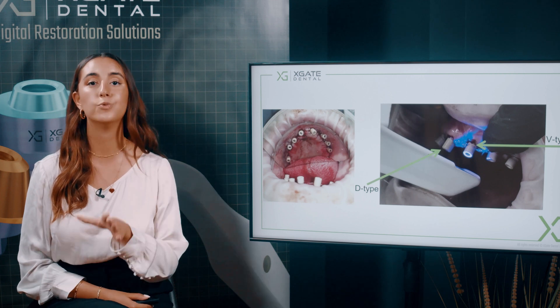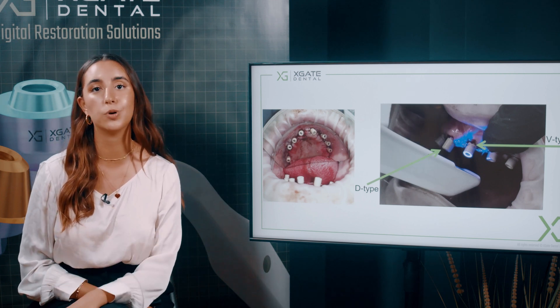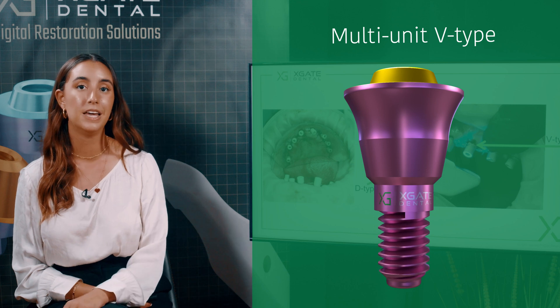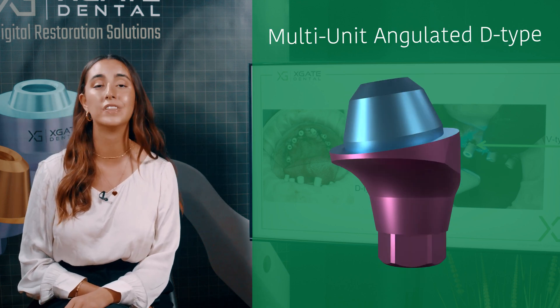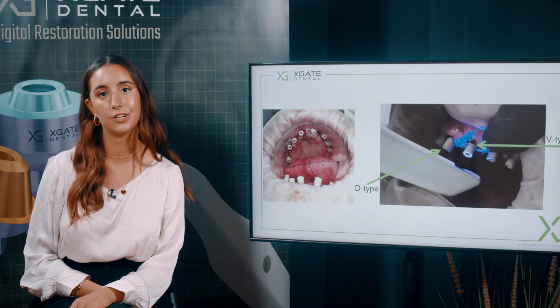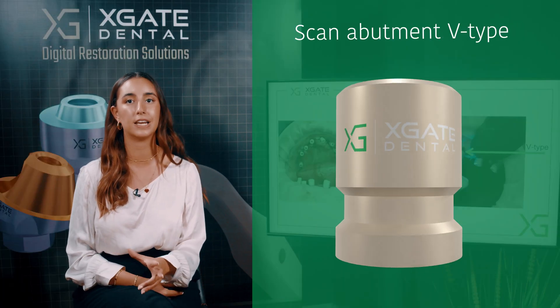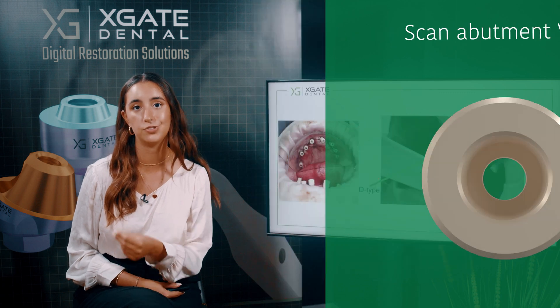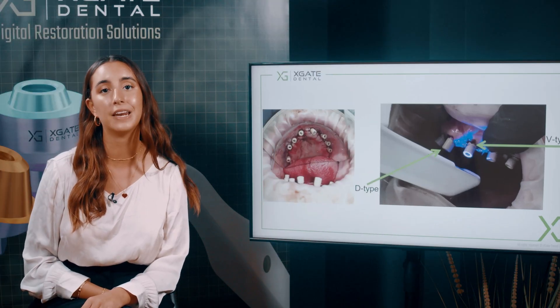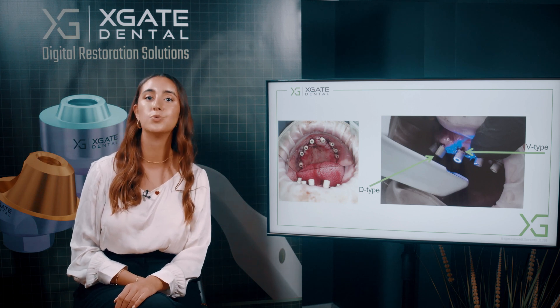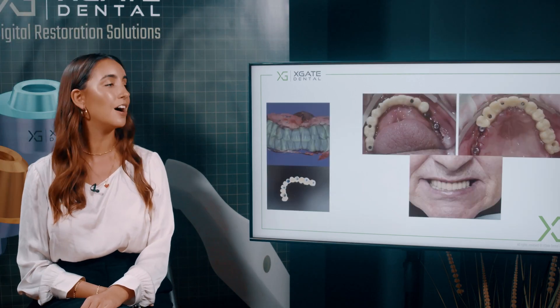The next step is taking impressions. We place scan abutments on top of all the multi-units. We use different types: for the straight multi-units we use multi-unit scan abutments of V-type; the angulated multi-units use D-type. So you have two different kinds of abutments. You can see by the ring around the scan abutments that we took impressions on top of all the multi-units.